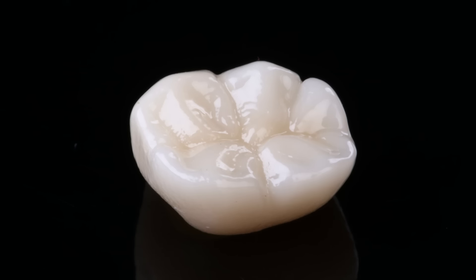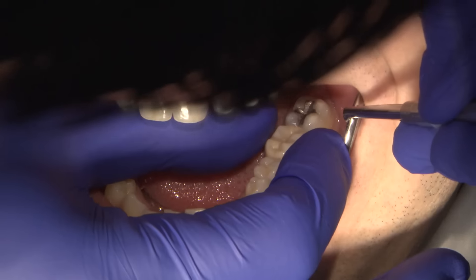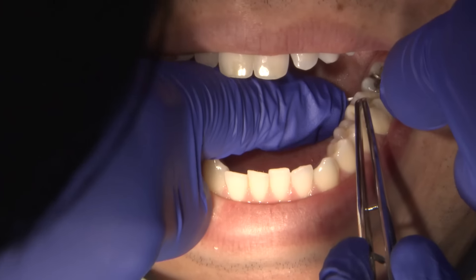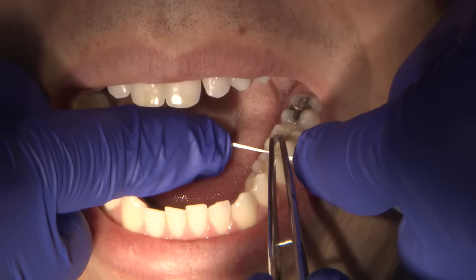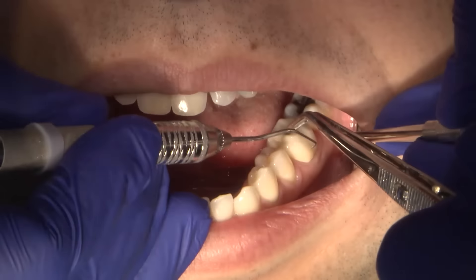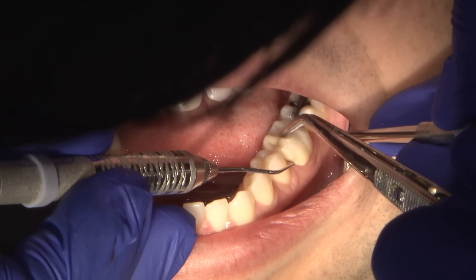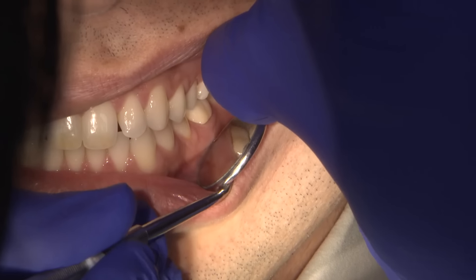Once the Bruxer crown is received, we can then try in the crown on the patient's prep. We can first check the proximal contacts with floss to see if any of those areas need to be adjusted. But in this case, sending it digitally, there was a shortened turnaround time, so any adjustments that are necessary are usually very minimal to none. When the contacts are verified, I will check the margins with an explorer to ensure that it's well sealed.